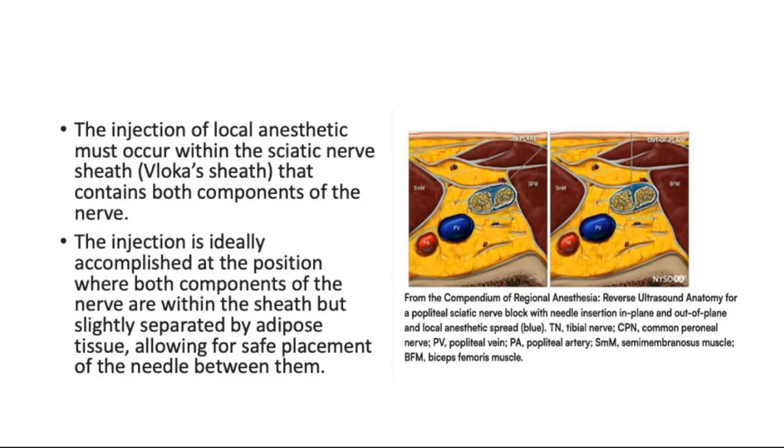That's why personally, if I have problems with imaging the nerve, I would scan the whole leg, because one of the good things about the sciatic nerve is that posteriorly you can scan the whole length from the popliteal crease all the way up to the transgluteal level.